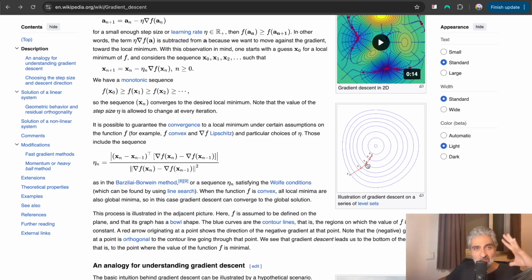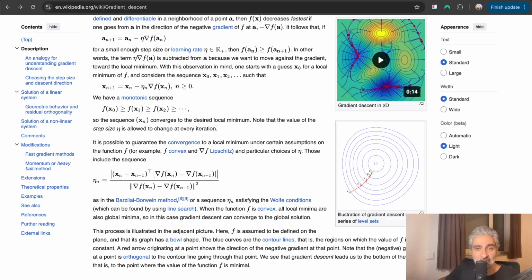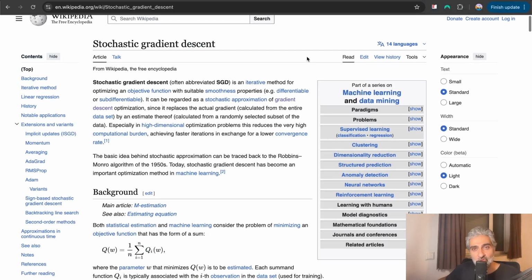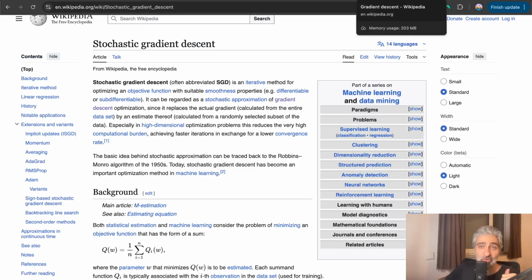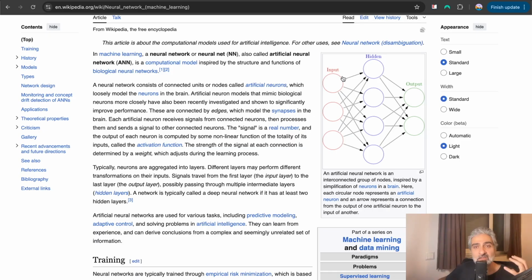But if you're dealing with multidimensional matrices, then it gets very computationally difficult. So there are now optimizers, like Adam, that we will use in our network. And this is basically a stochastic gradient descent. It reduces the loss, and then you correct the weights with something called backpropagation. Once you have the weights that reduce the loss the most, then the network has basically learned the statistical patterns in the input and managed to map them to the output based on this supervised learning.